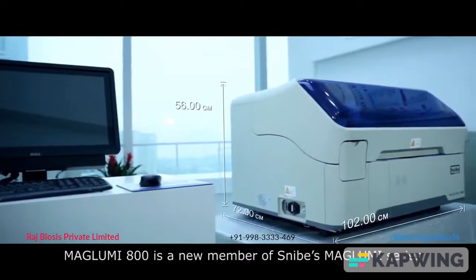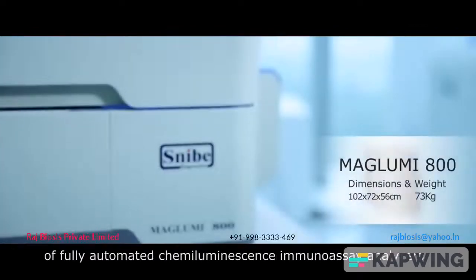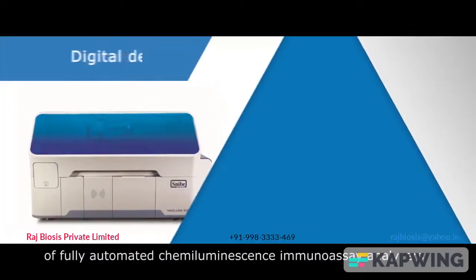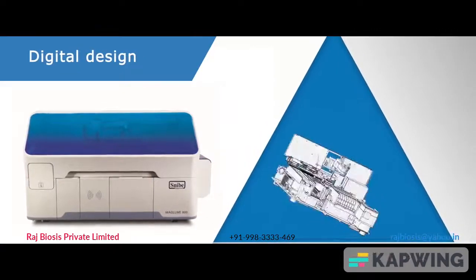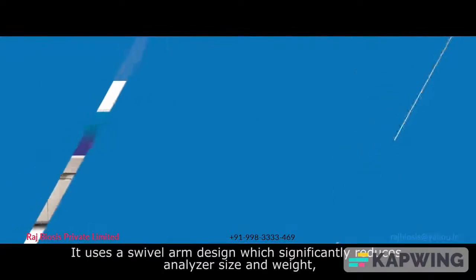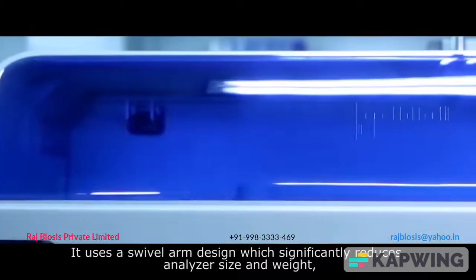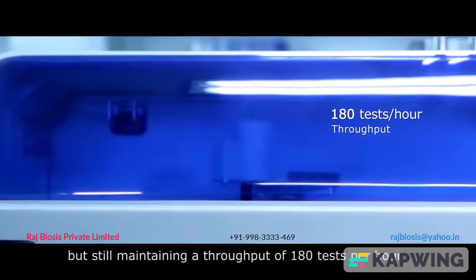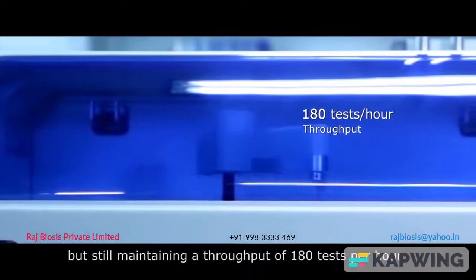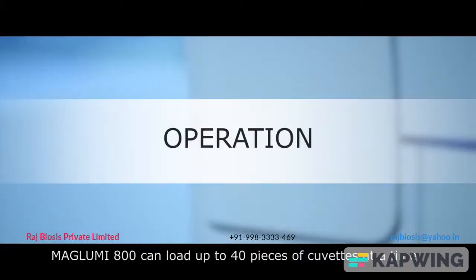The MAGLUMI 800 is a new member of Snibe's MAGLUMI series of fully automated chemiluminescence immunoassay analyzers. It uses a swivel arm design which significantly reduces analyzer size and weight, while still maintaining a throughput of 180 tests per hour.